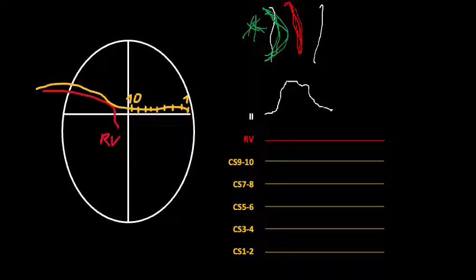Of course we've got the artifact of the pacing from the catheter in the right ventricle close to the septum, and then when we pace in this area with smaller energy, we just pace the muscle, the impulse goes down in the area of the apex of the heart, and then through the Purkinje fibers and heart conductive system, also through the bundle of His, comes back to the atria.